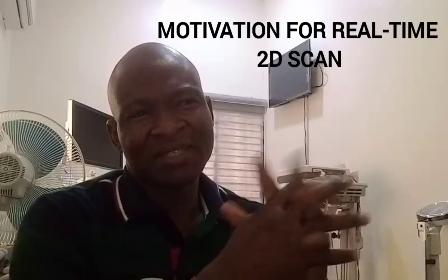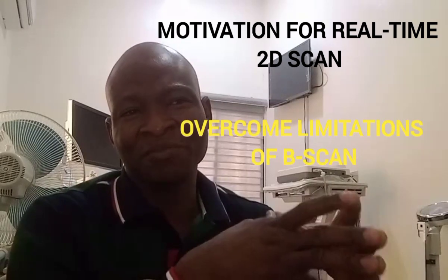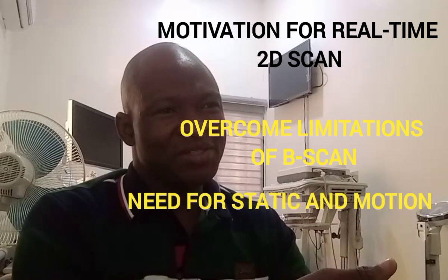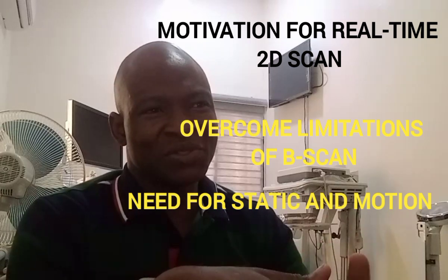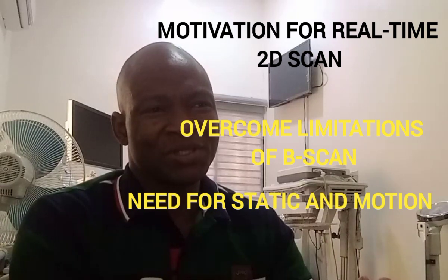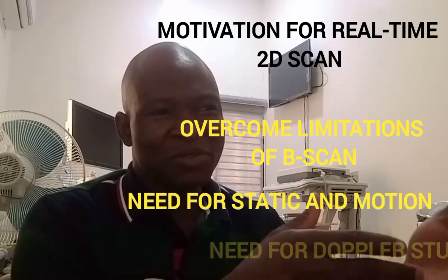What really motivated real-time scanning? To overcome the shortcomings of B-scanning, we needed to image both static and moving structures such as fetal movement, heart motion, and vessel pulsation. It needs to be recorded. And also there is a need to perform Doppler ultrasound.